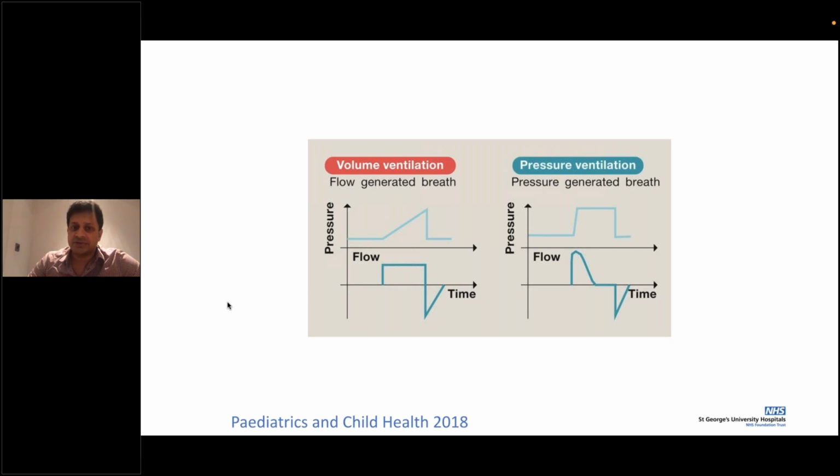And in pressure controlled ventilation on the right hand side, you can see that the flow pattern is an upright curve, which means that if you set the baby at 25/5, it will reach that 25 with no problem, very quickly. And in an otherwise preterm baby, where everything else is okay, it may not be as gentle a mode of ventilation for a premature lung.